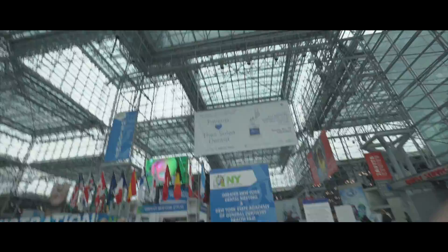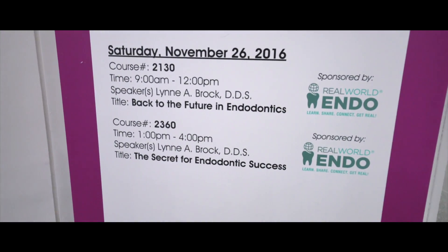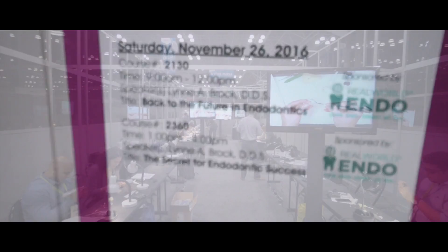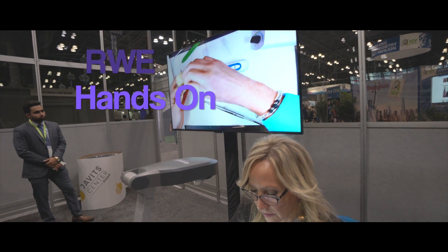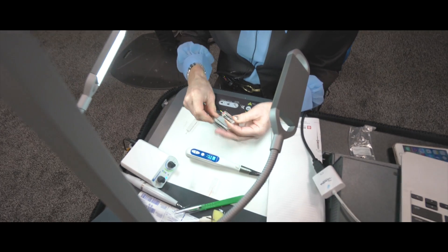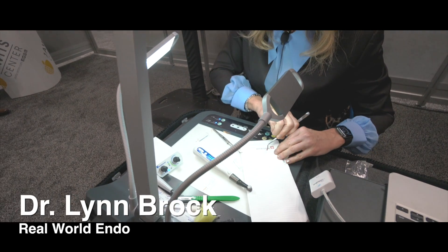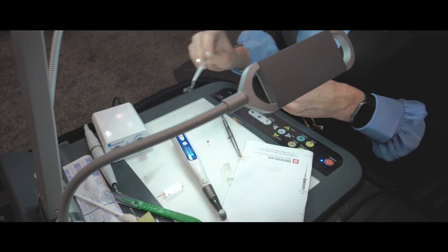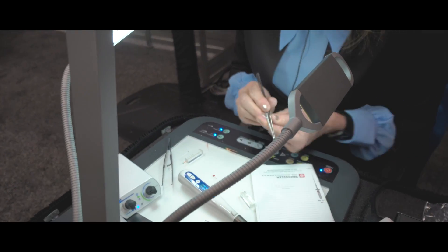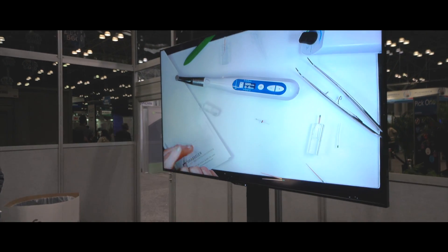We're at the Javits Center now. Our post length is just almost 10, and our gutta percha is right about 15, almost 16. So we're going to section.